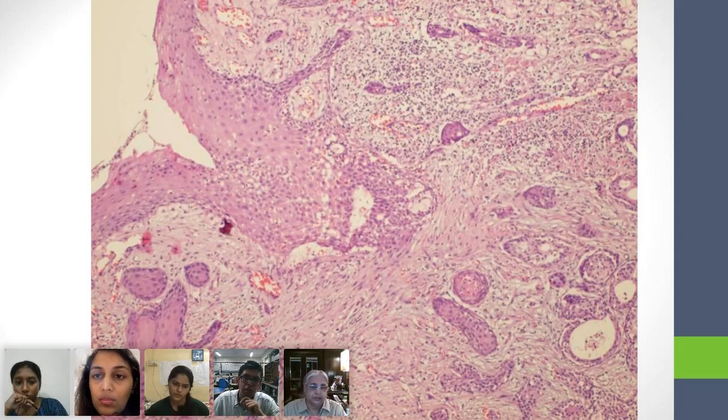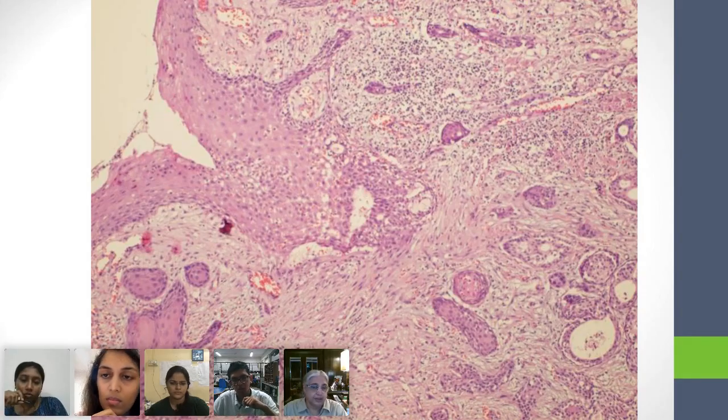There is a bit of squamoid differentiation of the ducts. Very good. You have ducts with lumina, and then you have other structures that look like they may be ducts. Yes, but the lumen is filled up with squamous cells. Yeah, and you can see that there's some here and there. So that is near the top.